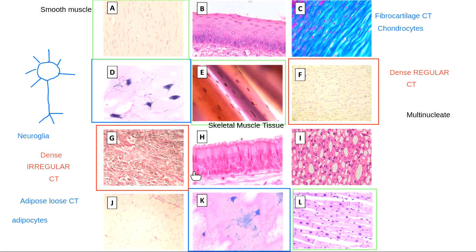This one right here is another one that we've talked about. Check out those nuclei going nuts. They're all over the place. What's that layering word for my nuclei going nuts? They're all over the place. Yep, pseudostratified. In your guided lesson, we called that fake it till you make it, right?